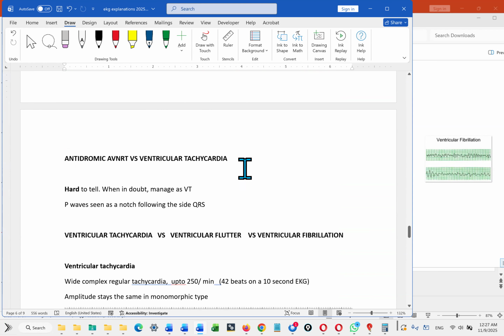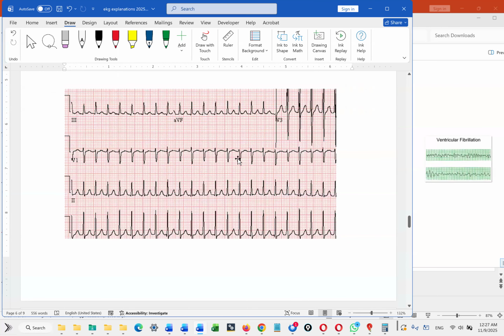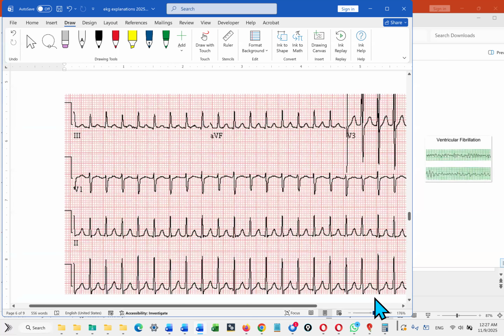Okay. Yeah, I think I could see the notch, but if you zoom into that picture, it's much clearer in V1. Yeah, it's hard. How do we zoom on this? Let's see. Actually, could you maybe upload this document to the chat?